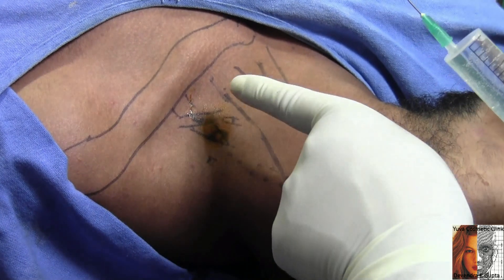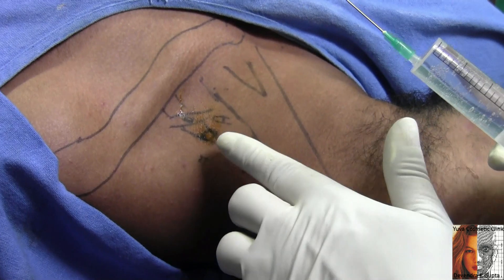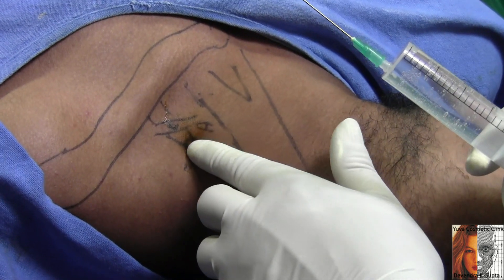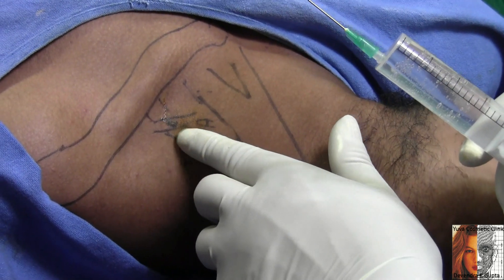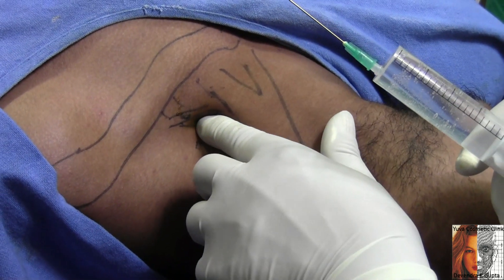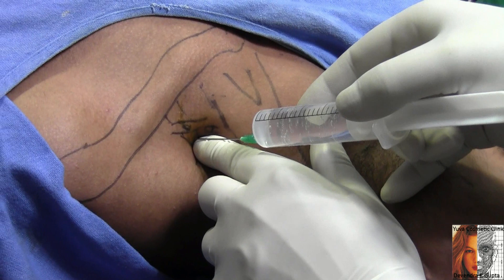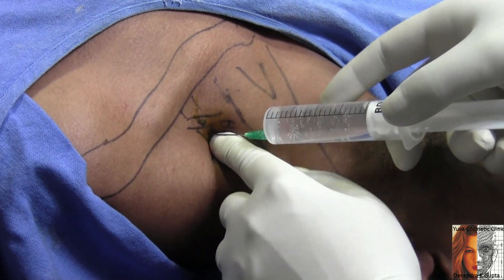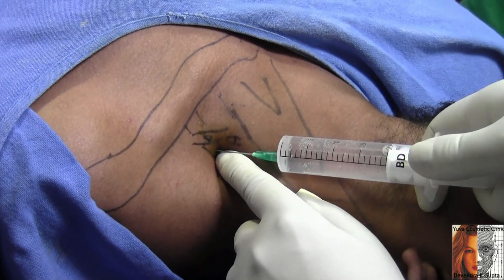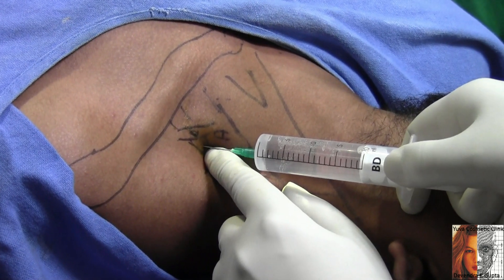I am giving the supra-omohyoid interscalene triangle approach for the brachial plexus, putting my finger in the interscalene groove cleft, moving my finger down to palpate the omohyoid, then coming back in the interscalene groove and inserting the needle. Aspirate and inject, aspirate and inject, slowly advance, aspirate and inject.